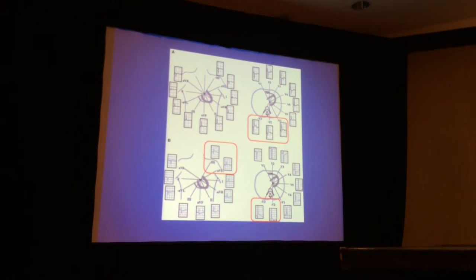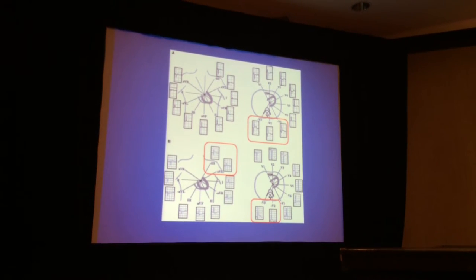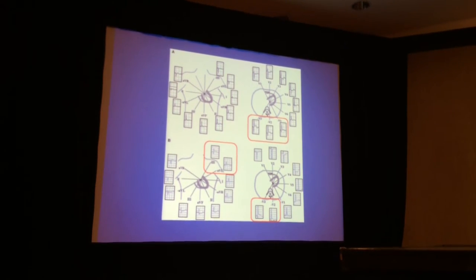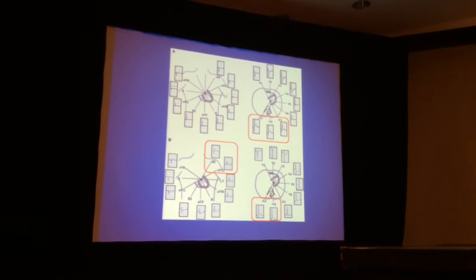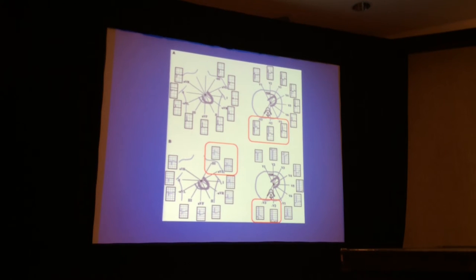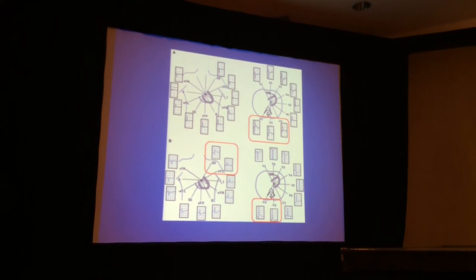But in fact, there is an adjacent lead, a contiguous lead, that has elevation. This doesn't happen to be a positive lead. It happens to be minus III. And obviously the same thing could have happened on the other side.